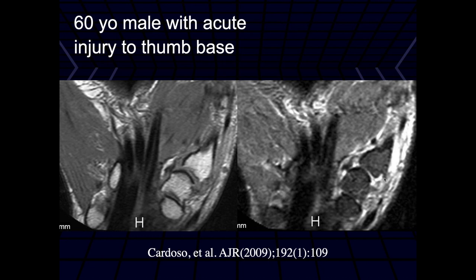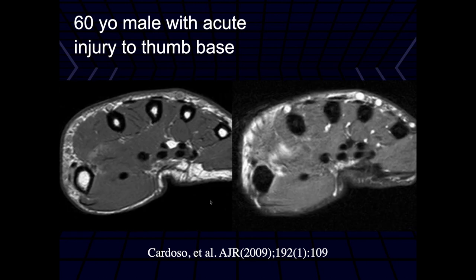This is actually a pretty high-grade sprain of the dorsal and the anterior oblique ligament, which are the capsule in those locations. It should be a nice thin black line going across, but these are tears of those ligaments.